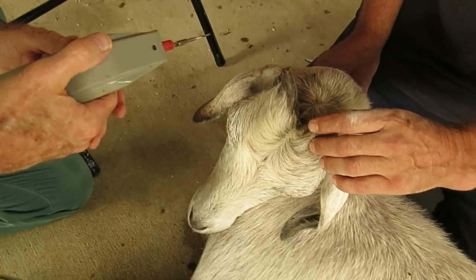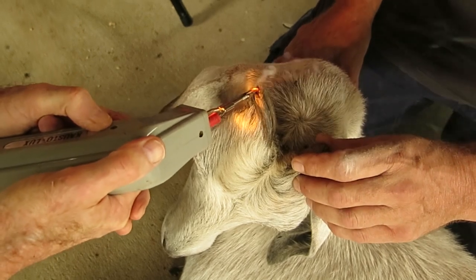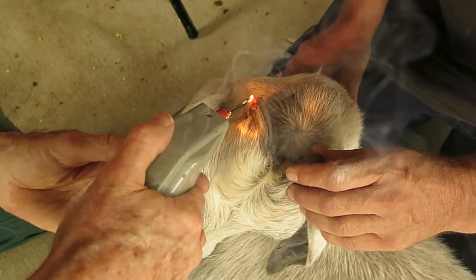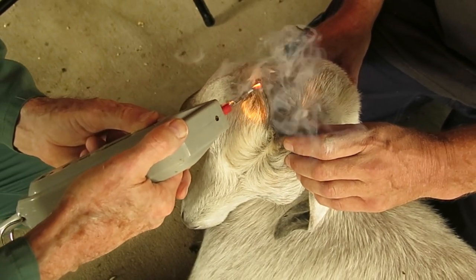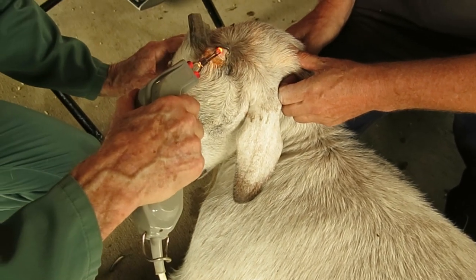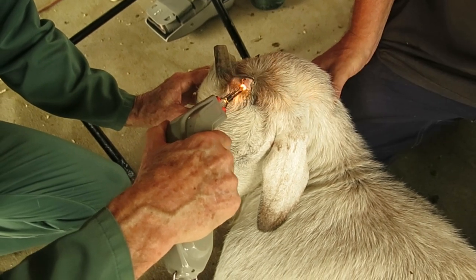Now we're using the electrocautery set to seal blood vessels that have been exposed. On this side you can see the blood vessels — that's just been cauterized so it doesn't bleed.